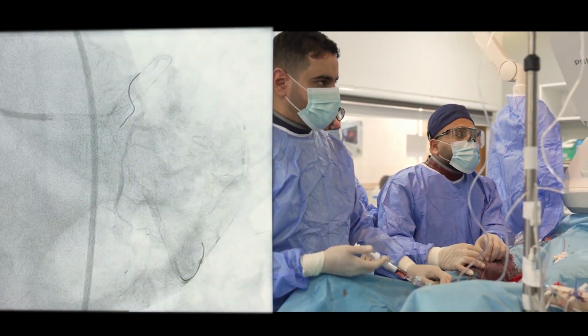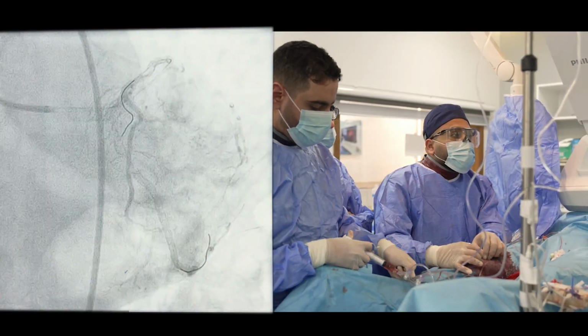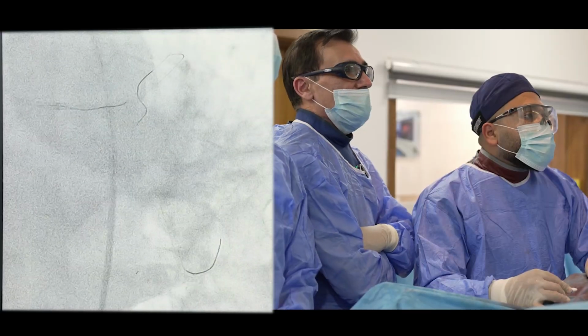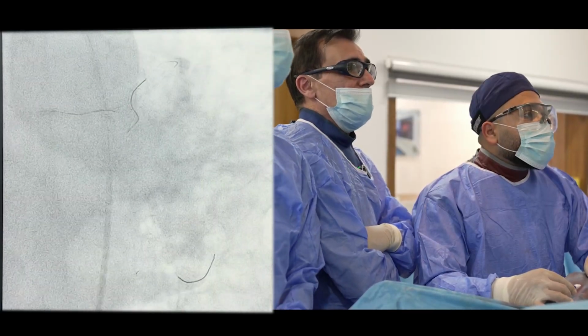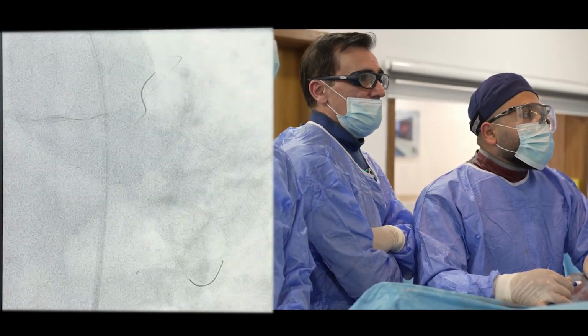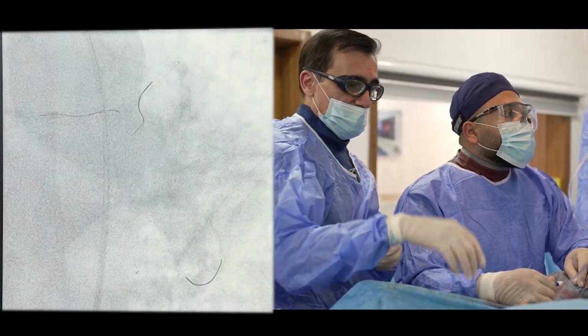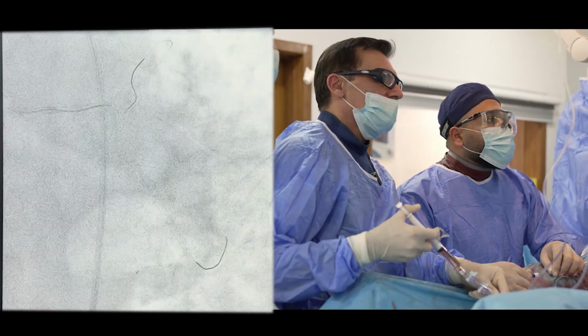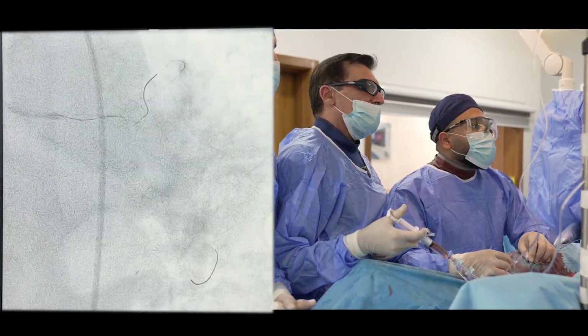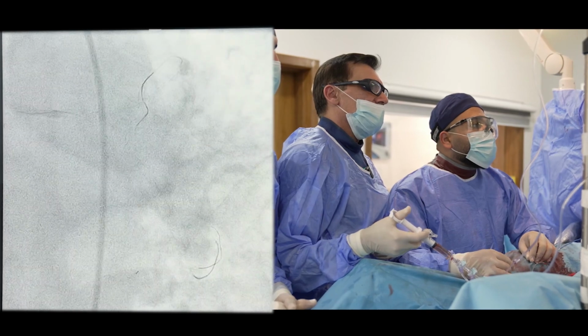Okay. I think we are going to take a third wire to recross. We decided on a provisional stenting. So the wire goes to LAD and we try to go to the most distal strut part of the bifurcation. Yes, okay. Test, let me see. Probably we need some larger angle.